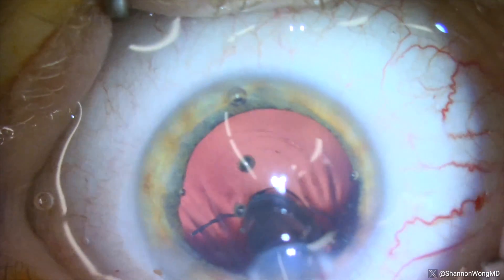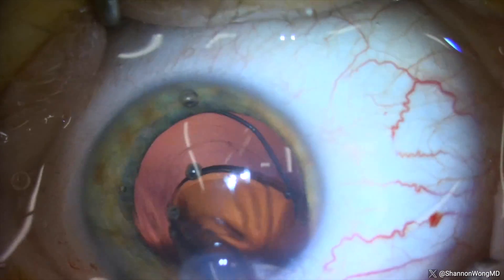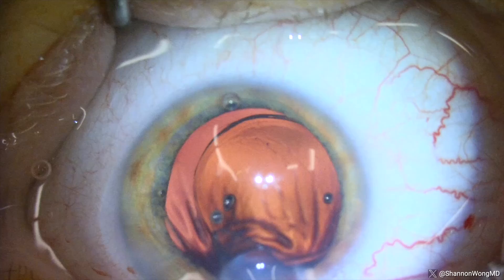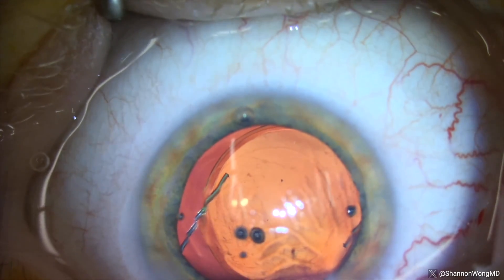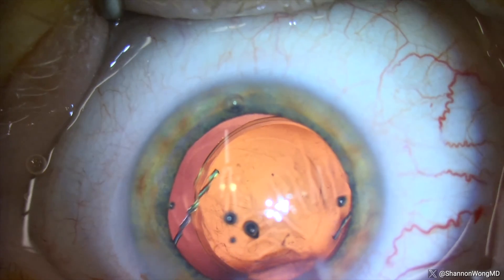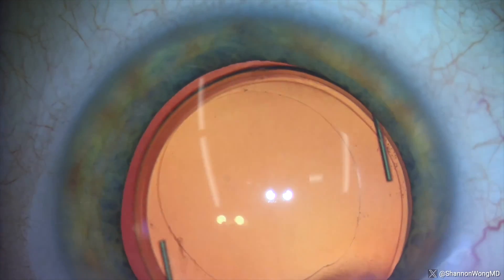In order to deliver the lens in the normal position, we have to rotate the cartridge counterclockwise — or slightly to the left — about 90 degrees, so now the bevel of the cartridge has moved from facing the posterior capsule to facing to the right. We then deliver the lens and the trailing haptic into the bag successfully. At the conclusion of this first LAL insertion, the LAL looks beautiful in the eye. This is the by-the-book insertion method.